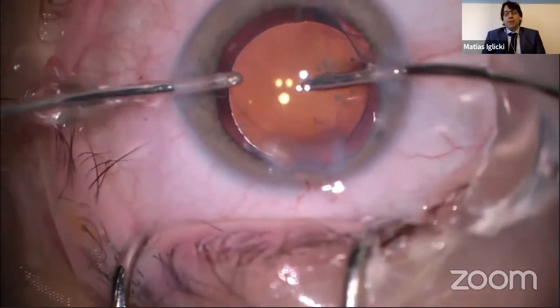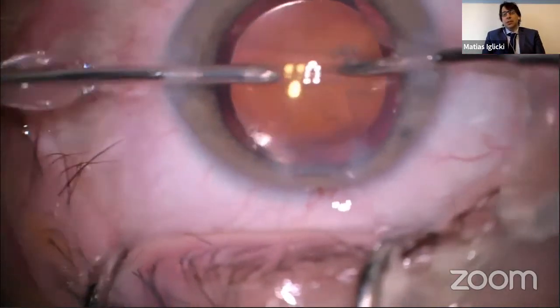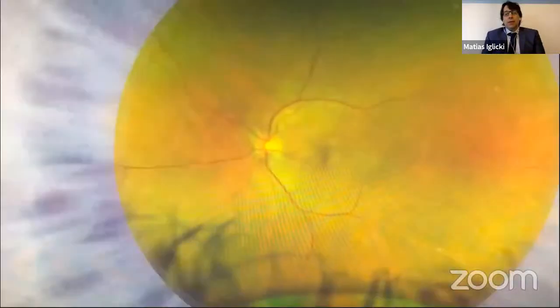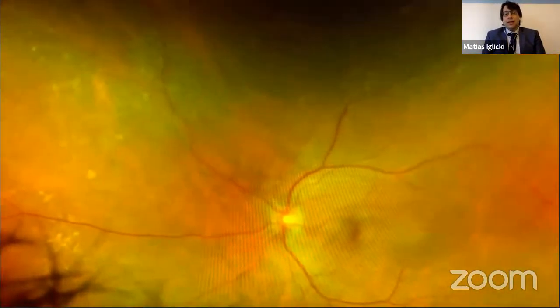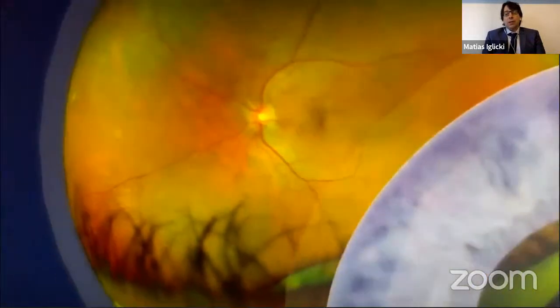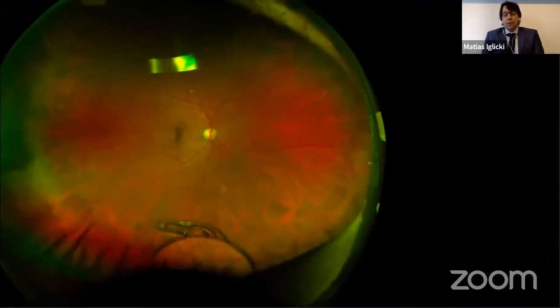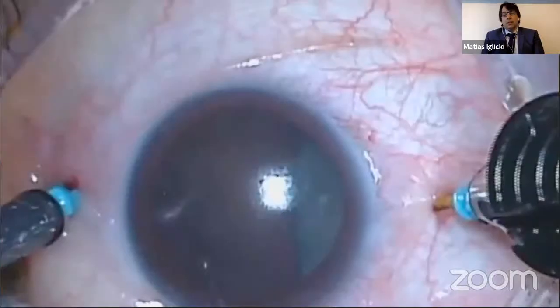Everyone is happy, the patient is happy, but in a diabetic patient, that condition is not that common. As you might see, due to the details that they will tell us, we can face this kind of consequence, which is the lens inside the eye in this diabetic patient, or even more, an intraocular lens, as you might see here, inside the eye. And we have to face this and do it properly. And the easier the technique, the better the result.